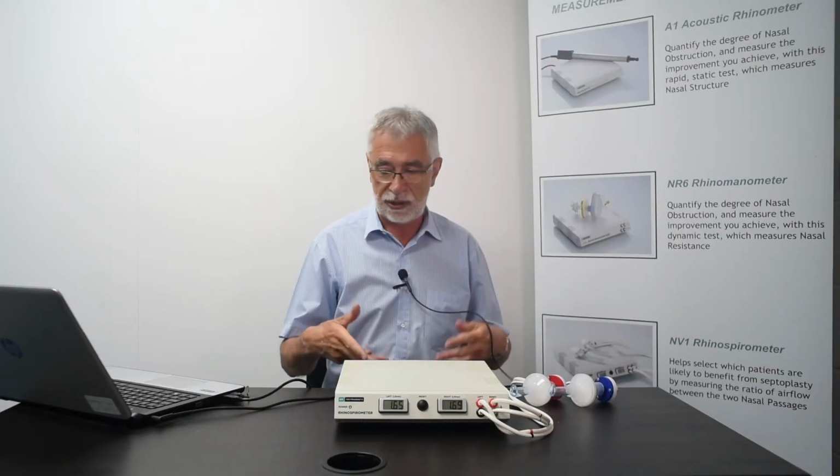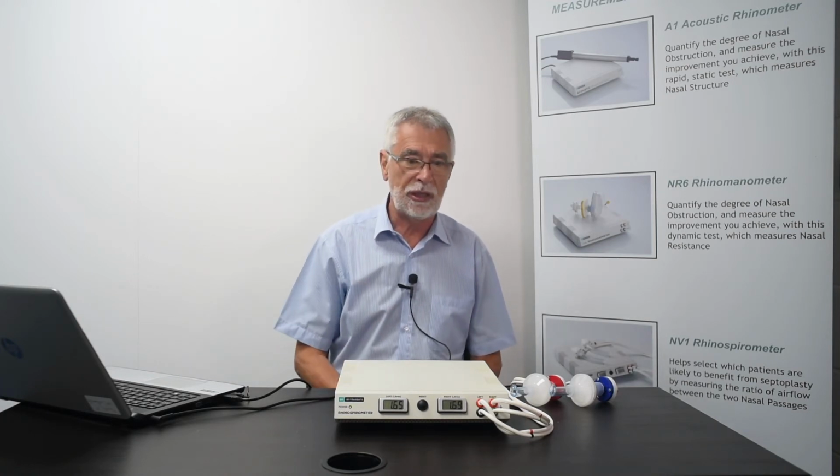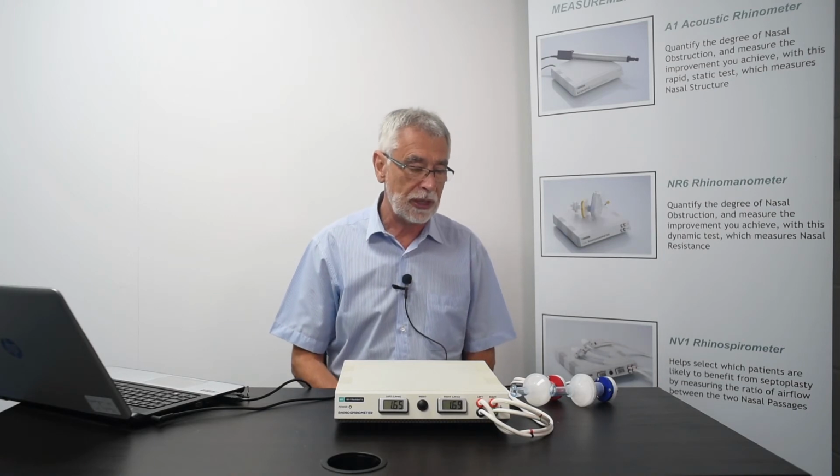I did a simple single inspiration there. If you wish, you could ask the subject to do it over 2 or 3 breaths, depending on the levels of volumes that they achieve. And that way you can average out over the number of breaths.